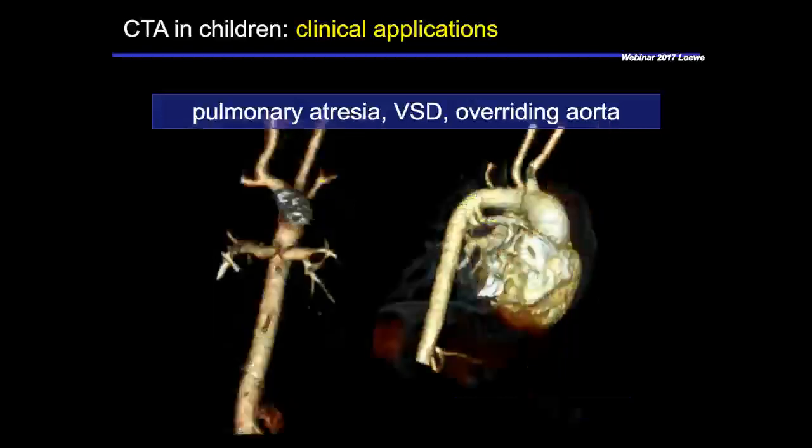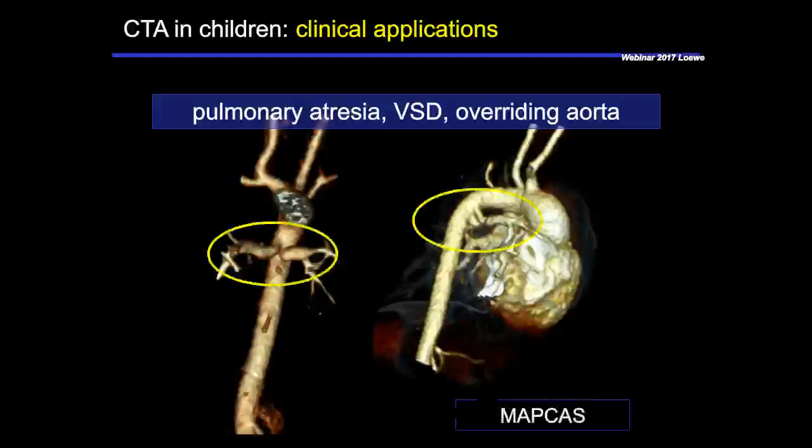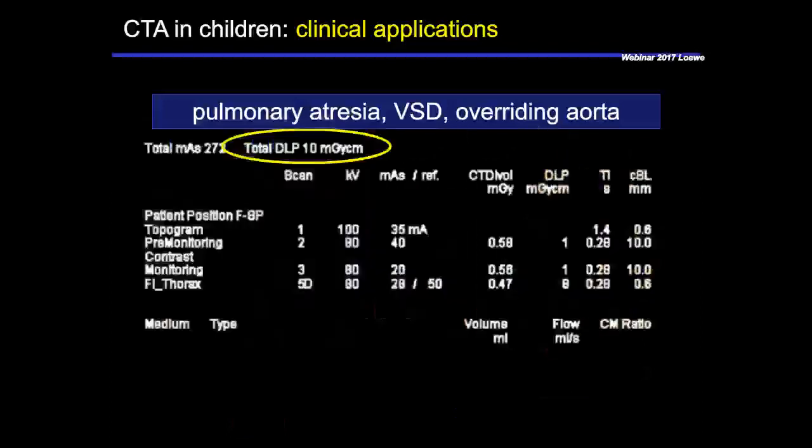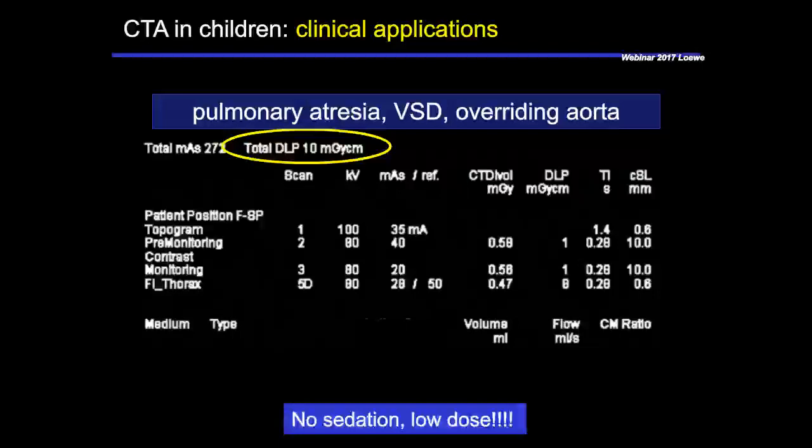Of course, we can also look at the perfusion of the lung parenchyma, and the very nice story is always to look afterwards at the patient protocol, because the total dose is very, very low. And it's always and still fun to look at these cards, because it's really a breakthrough in the clinical management of those patients.